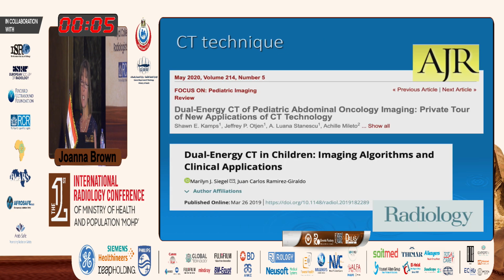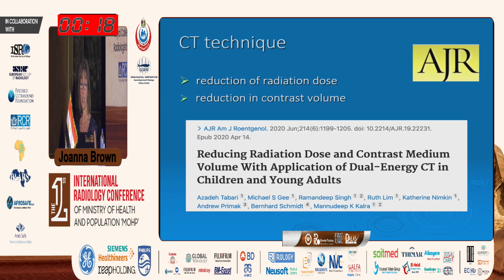The one thing I wanted to stop on for a minute is dual energy CT, which we are starting to have more and more often in our departments. When this was introduced a few years ago, there was always a query about increased dose, but now we have several multi-center studies showing good outcomes using dual energy CT.